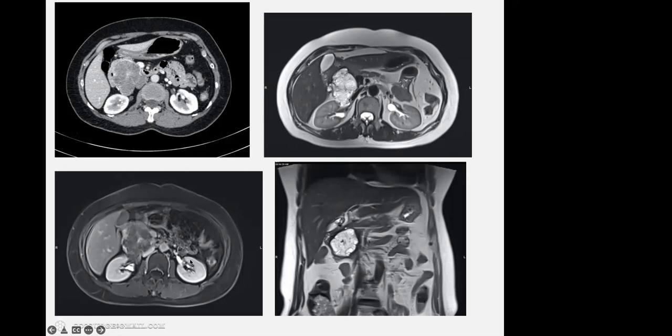At this point, I would tell you, we have something called microbubble contrast in ultrasonography also. Even nowadays it is not very popular in India, but in the Western world, many centers do routine contrast-enhanced ultrasonography using microbubbles.